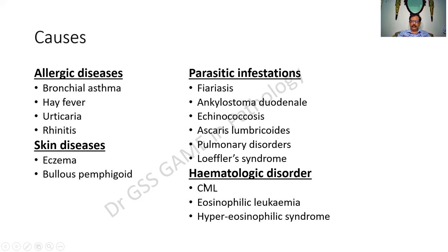Hematological disorders, please do not answer this as the first cause. CML, eosinophilic leukemia, and hypereosinophilic syndrome. These are all, some can be seen, but whenever you give the answer, give the common things first and later the more difficult ones.